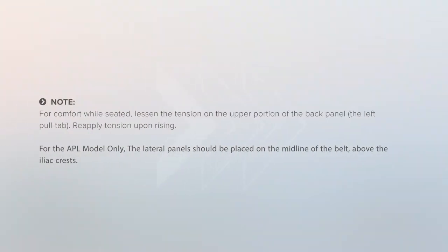Note: for comfort while seated, lessen the tension on the upper portion of the back panel using the left pull tab. Reapply tension upon rising.